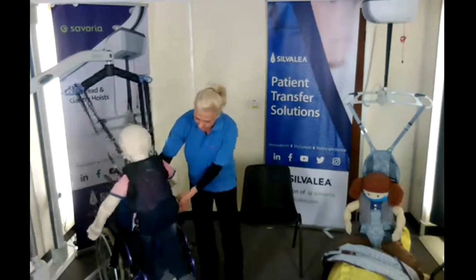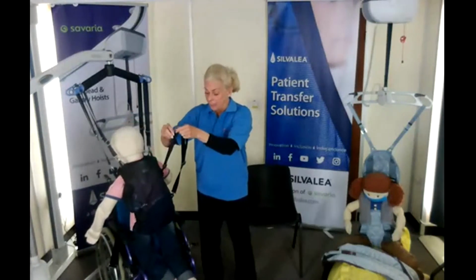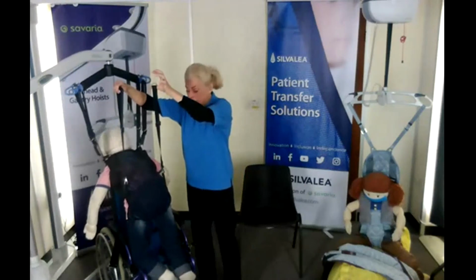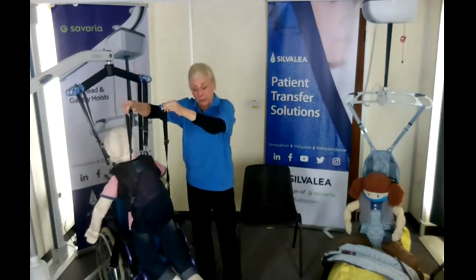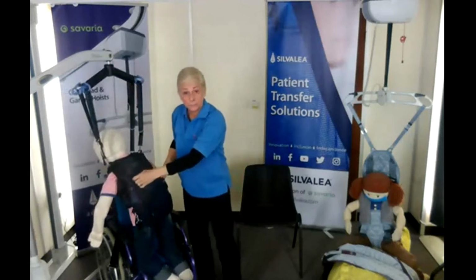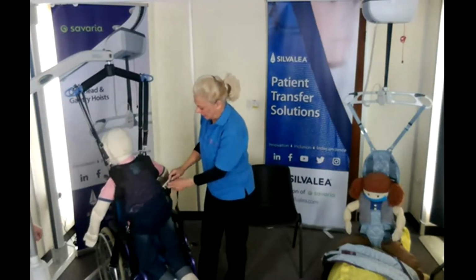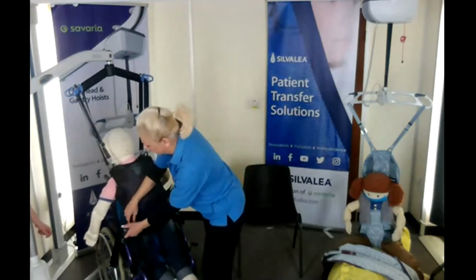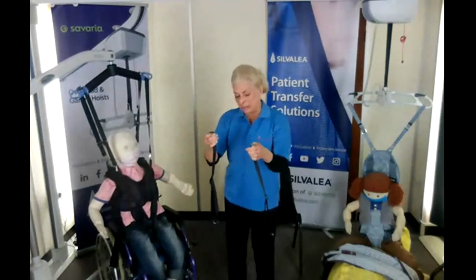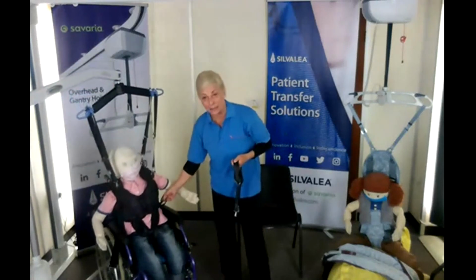because the sling comes with these tapes here. So these are hip tapes, and all the tapes are on adjustable sliders. And this, if it's adjusted and hooked up, will help to get into a prone position. So we can see effectively what that is designed for. So if it's at the right setting, then you can get into the prone for going onto a wedge, things like that. Quite often they are detached and not used. So I know that because we don't ever see any with hip tapes come back or, you know, talked about. So the hip tapes probably just get taken off and they're not used. But that is the whole reason they're there. And if you see there's got a loop at the hip, it's for that purpose.